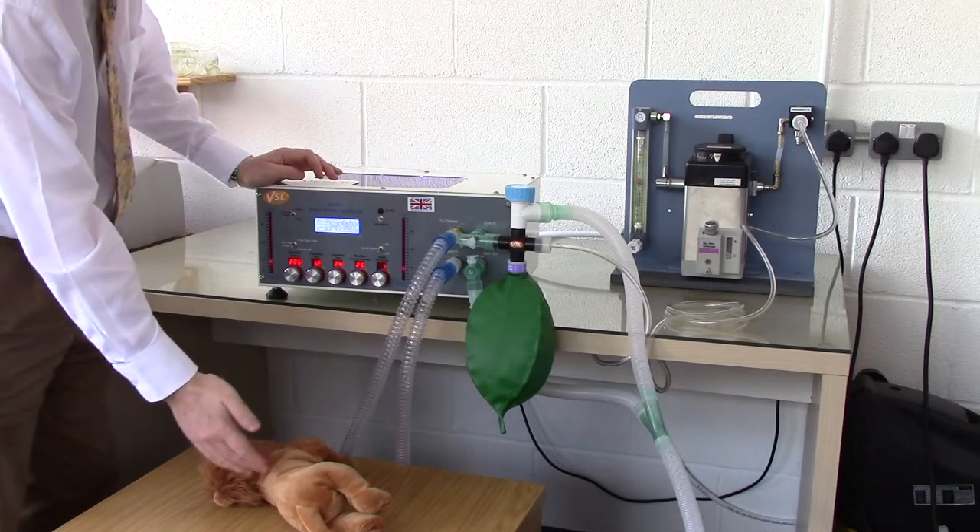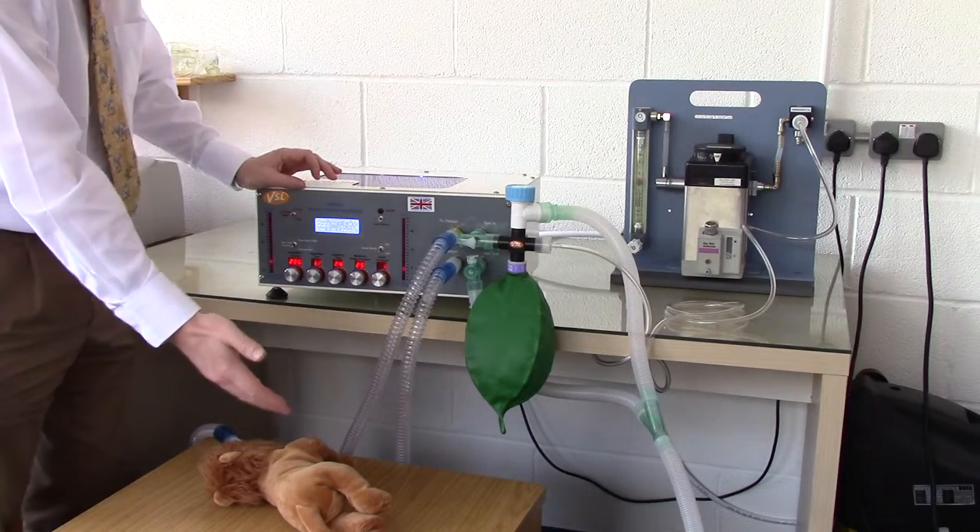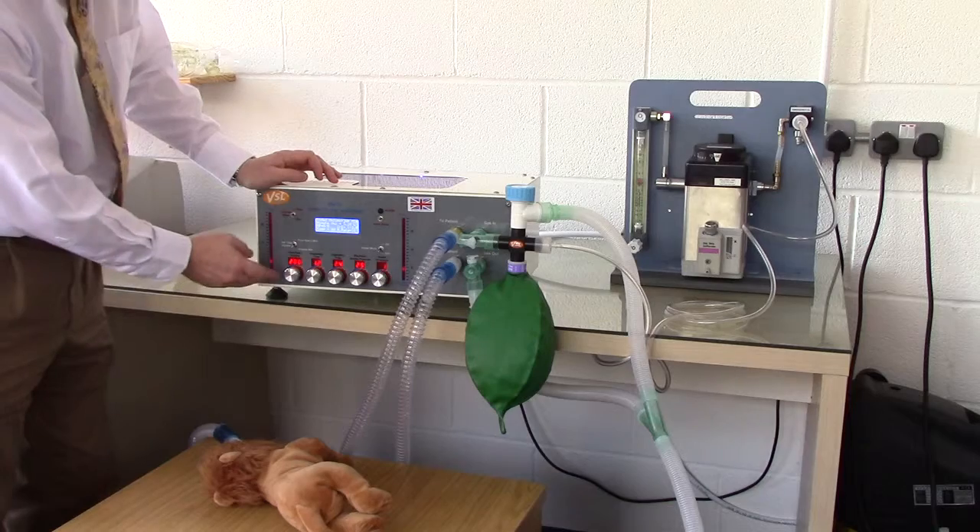I will now describe ventilating a patient using the non-rebreathing setup. We will now ventilate a dummy animal with a tidal volume of about 200mL.